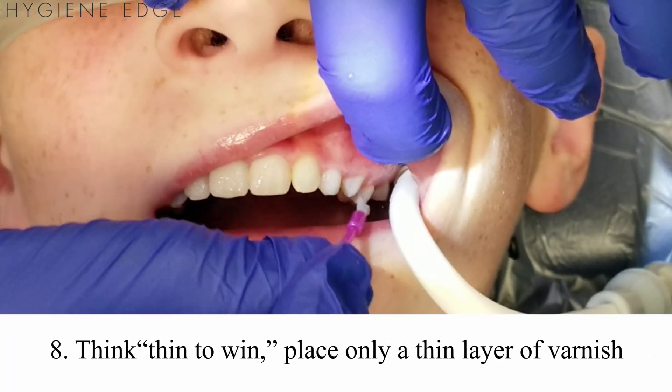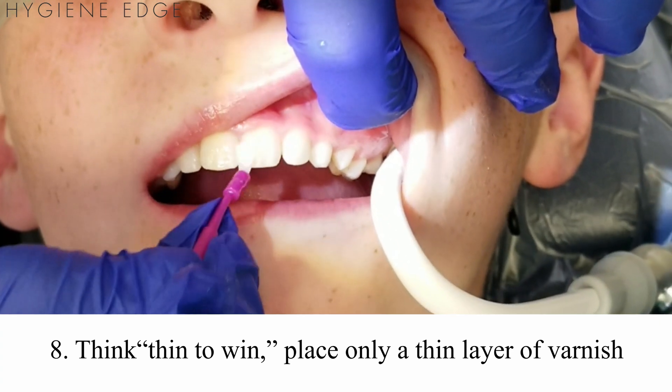And last, remember: thin to win. You don't need to place it thick on a surface for it to work, and patients will tolerate it better.